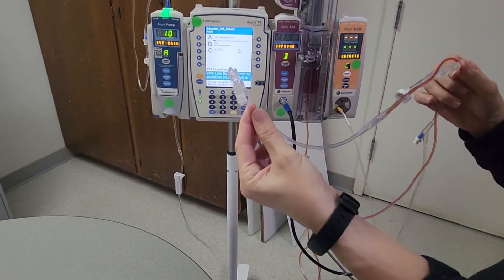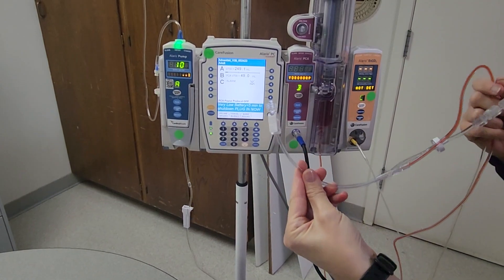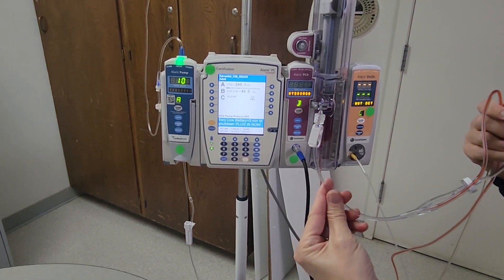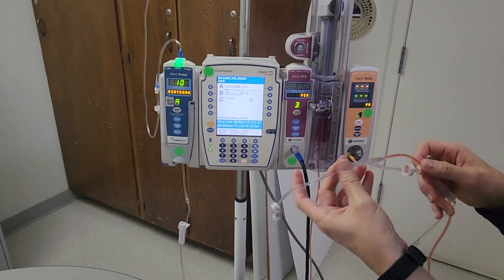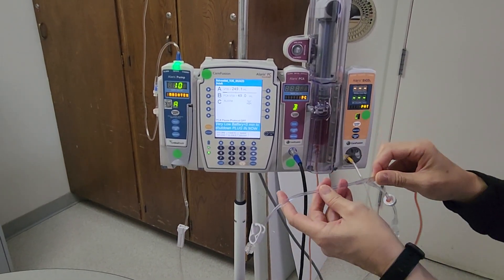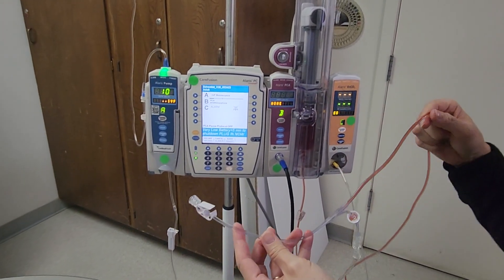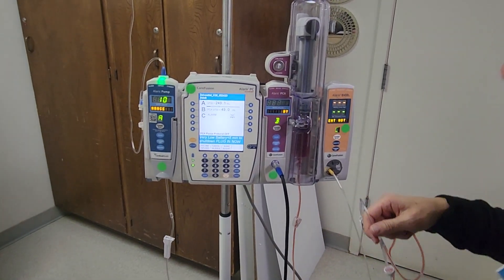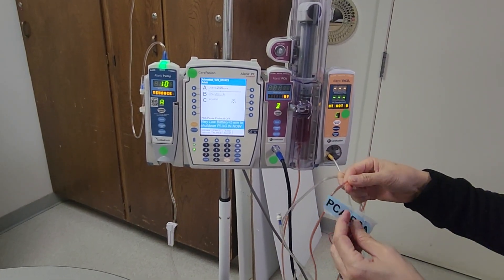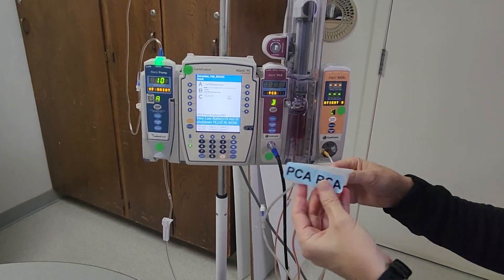To reiterate: a key important part of this is to make sure that you are priming your PCA tubing in the appropriate order. Follow policy and the instructions inside the packaging — prime the medication only to the Y, and prime the remaining portion with carrier fluid before starting the PCA, to avoid any complications. Lastly, put away the PCA key in the Pixis, secure it, and use your PCA stickers to label your tubing.